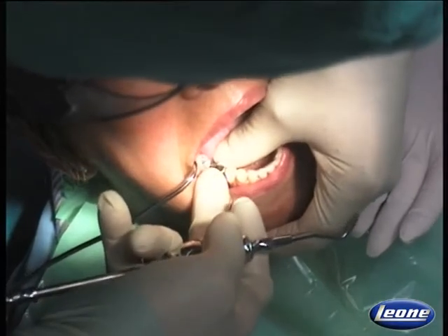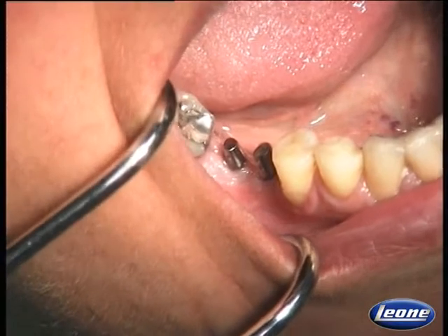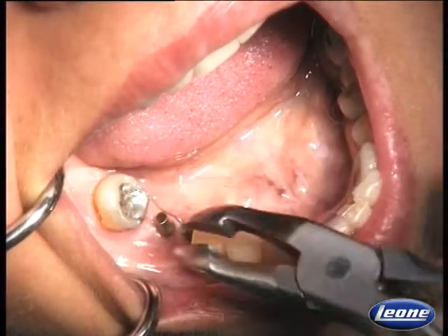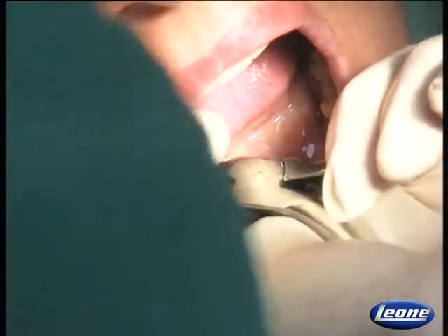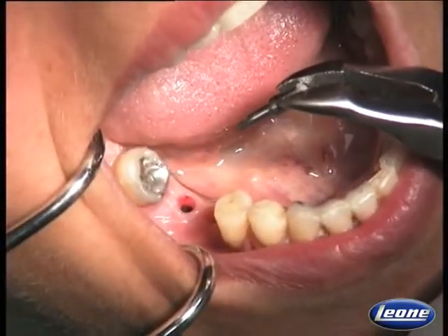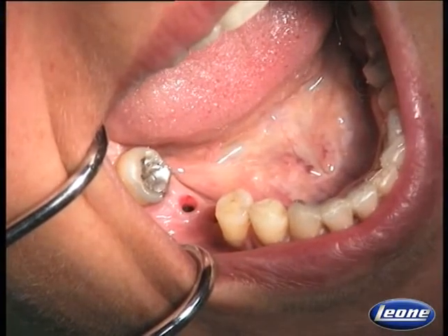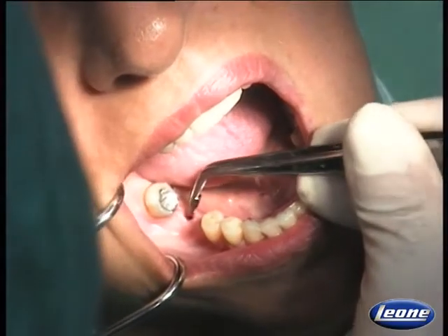I remove the framework with a bridge remover and remove the abutments by means of a Wingate style plier. I grasp the abutment with a plier and apply a pulling force along the implant long axis. We rinse and dry the implant's inner part and reposition the healing caps.